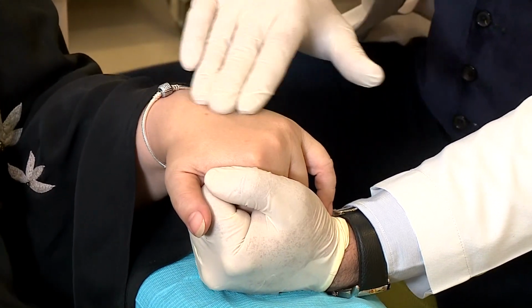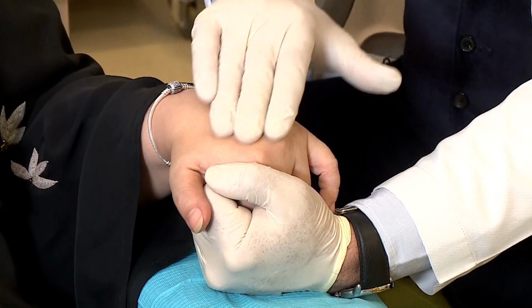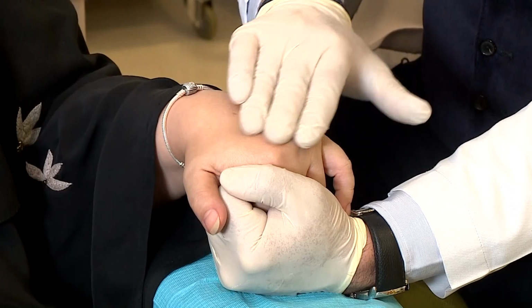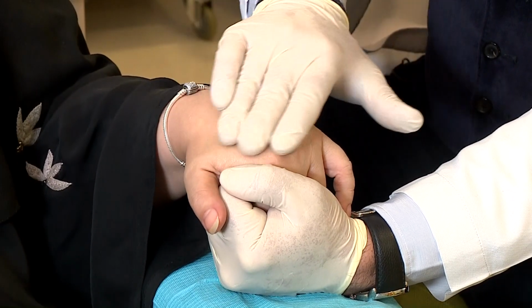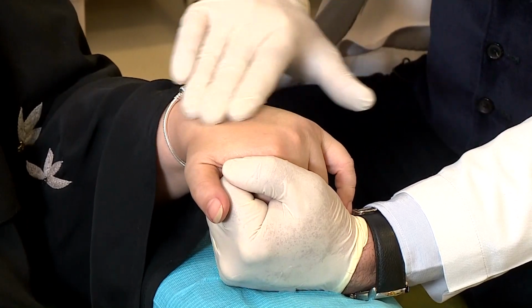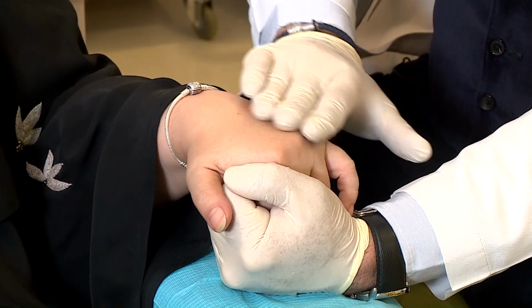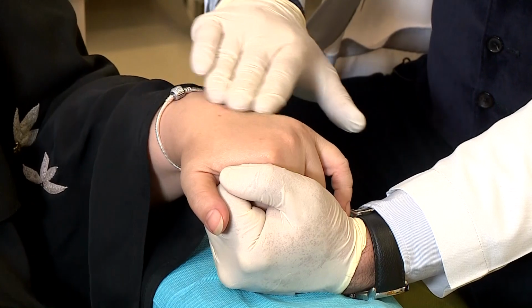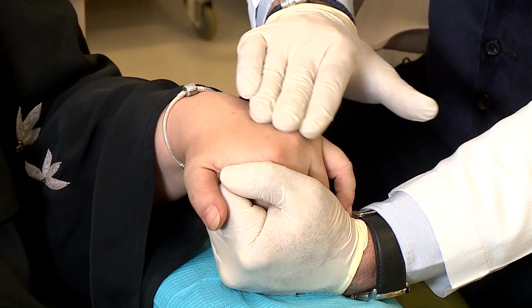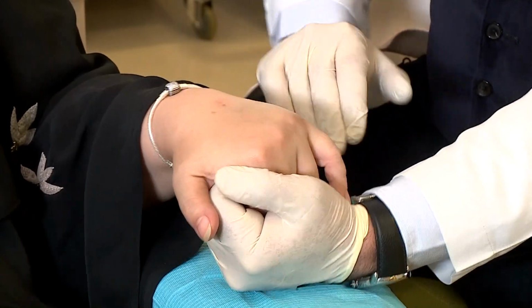And as we know, the Radius is also going to stimulate the normal collagen process and also will enhance the vascular supply of the hands. So we're expecting more hydration, better skin quality, and also better volumizing for the hands. It's an easy procedure with a very high satisfaction rate from the patient.